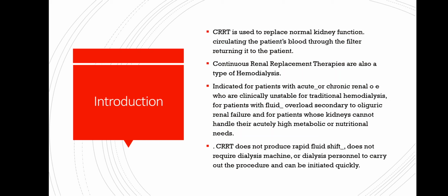It is secondary to oliguric renal failure, for patients whose kidneys cannot handle their acutely high metabolic or nutritional needs. CRRT does not produce rapid fluid shifts, does not require dialysis machines or dialysis personnel to carry out the procedure, and can be initiated quickly.